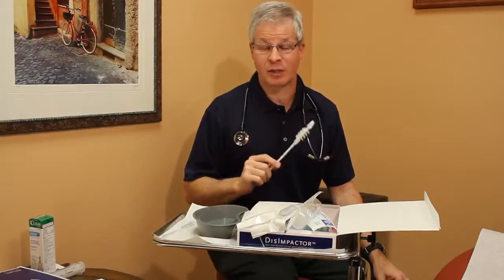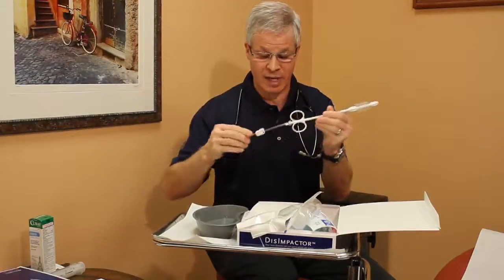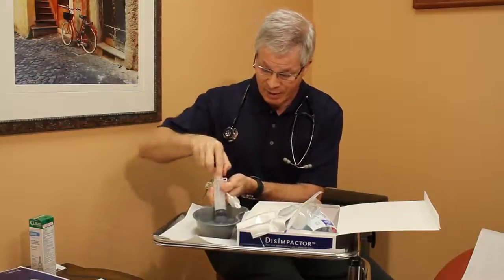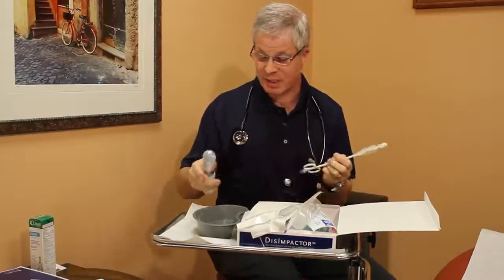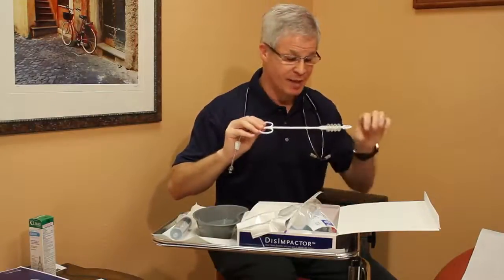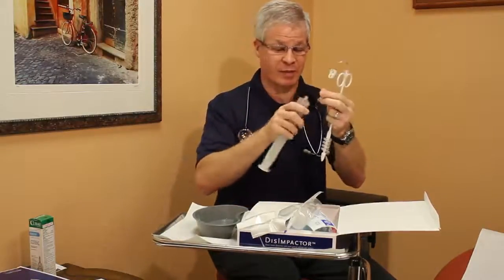It's this device through which we'll instill the enema fluid. So as we prepare our third device, you can go ahead and attach the luer coupler to the device, and you'll want to make sure that your syringes of enema fluid are ready. So typically you'll have emptied your enema fluid of choice into the basin, and it's usually about 120 cc's, and so it's 2 of the 60 cc syringes that you'll need. You'll begin the procedure again, just like with the first 2 passes, well-lubricated device into the rectal vault, but this time you'll pause because you'll want to couple the syringe directly to the device.